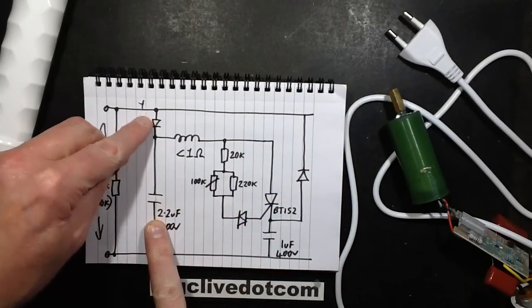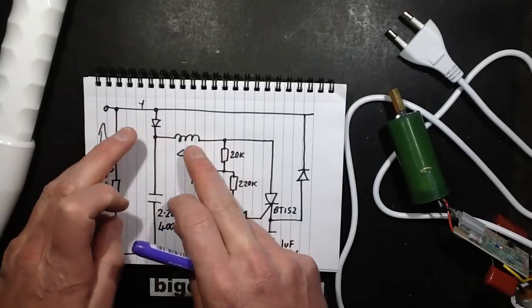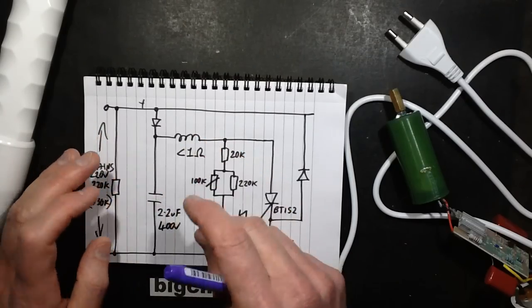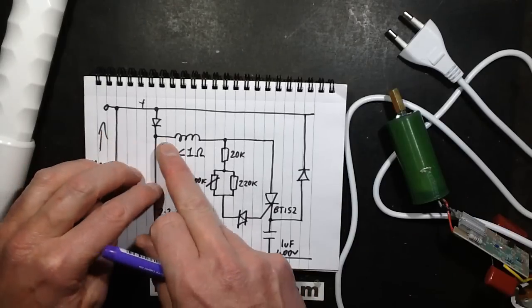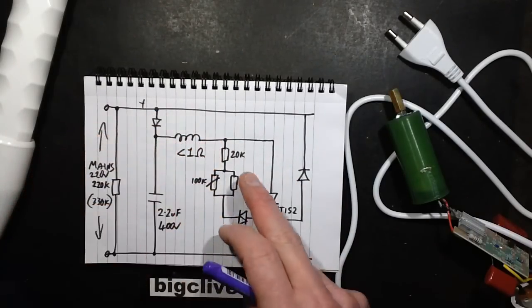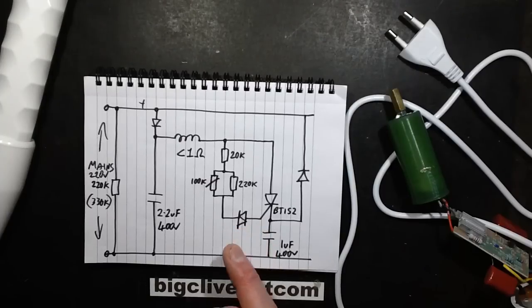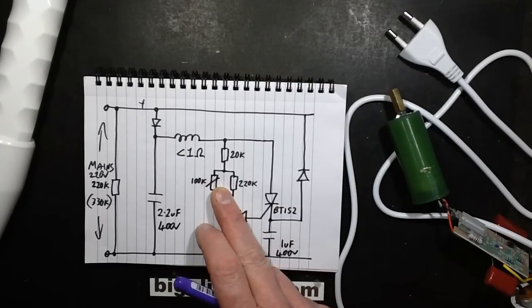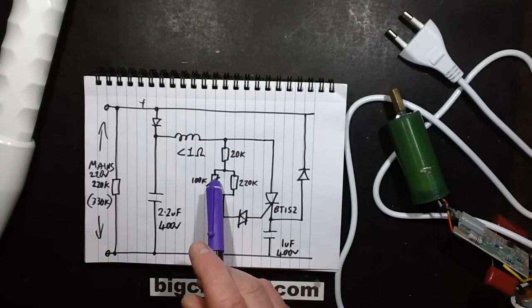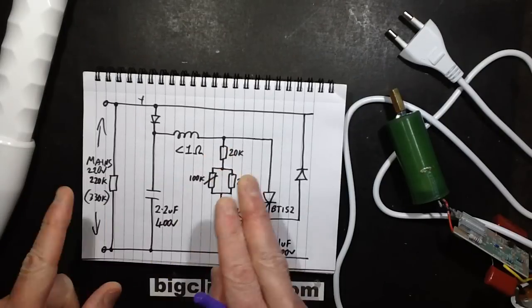This capacitor starts charging through this diode, and not any significant current will flow through this coil, nothing that would have an effect, because it's a very low impedance. So as the voltage in that rises, it triggers this thyristor via this resistor network and this threshold detector, the diac. And at the lowest setting, this 100k potentiometer is basically at 0 ohms, and it's shunting this whole thing out. So the only resistor in circuit is the 20k, and that's at the lowest setting.